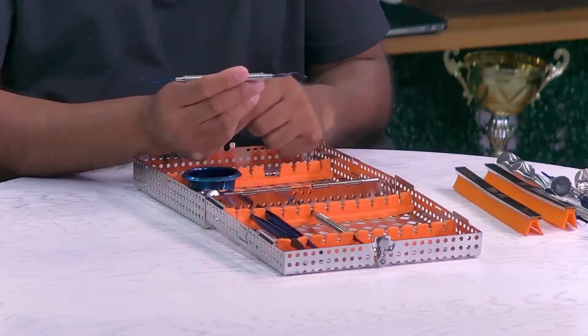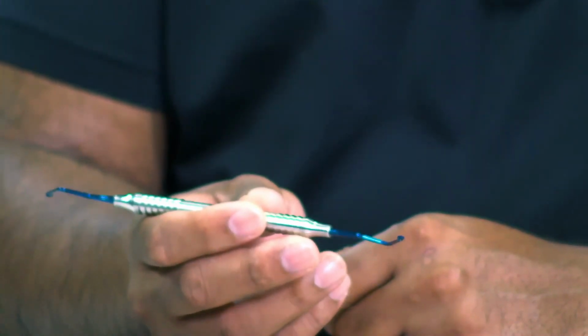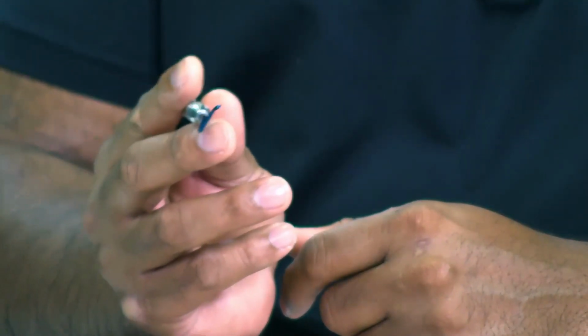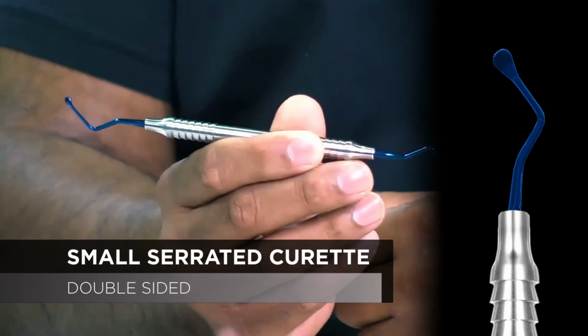Also, when it comes to extraction time, one of the things that we always need when we're taking out teeth is we want to have a nice clean socket. We want to remove any PDL remnants there may be, certainly any granulation tissue, and nothing does that better than a nice curette, serrated curette in this particular case. It does a great job of removing all of that remnant granulation tissue, PDL, and really does a good job of cleaning that socket out quite nicely. And it's a nice size that gets all the way down to the apex, even on your smaller molar socket as well. So that's one of the reasons we have that instrument there.